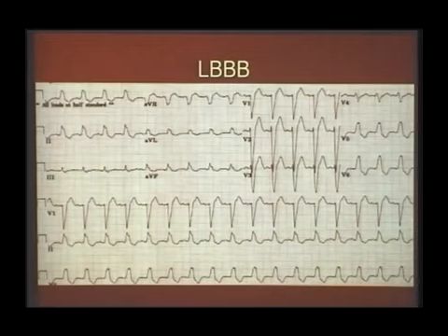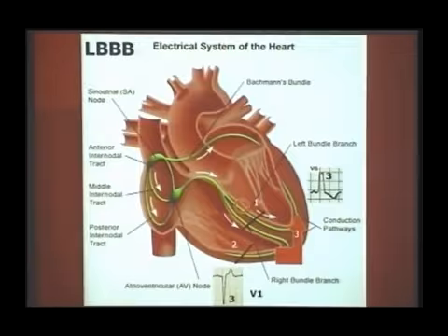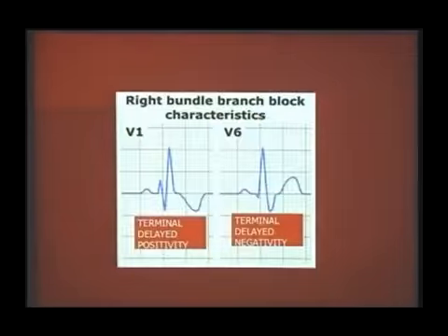So once you decide it is a bundle branch block, look for the slurred positivity, where the slurred positivity is. Is it in V1? No. Is it in V5, V6? Yes. So what bundle branch block is this? It is written very nicely there. So what bundle branch block is this? Left bundle branch block.